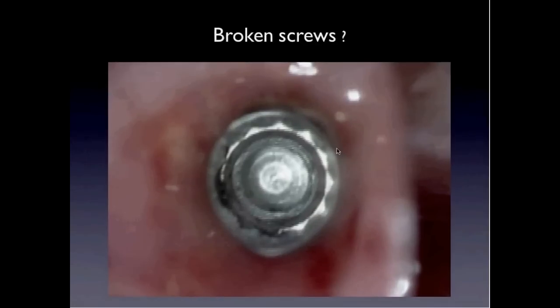Have you ever had broken implant screws? If not, you were quite lucky. Luckily, I had 3 up to now, and I was able to remove 2 with the help of a microscope. I could just loosen them with a probe, but on the 3rd one I used the ultrasonic device and thought I could get it out, but instead of that, it was welded to the implant, so I had to use a burr to get it out, and of course I damaged the implant a little.